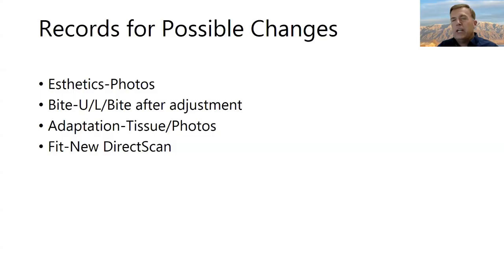If it's fairly major changes, midline, angulation, buccal corridor, things like that, we should do another prototype because, again, we want a prototype that the patient likes before we go to finish.